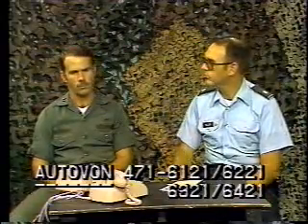Okay. One last question before we leave, and we've just about covered this topic about as well as anybody could cover it. No sense in beating a dead horse. You see a lot of situations in the movies and in the field where a man will put a harness over his shoulders and attach it to the handles of the litter, so that a lot of the weight is on his shoulders. In other words, when he stands up, it's actually a harness type of thing. Is that an approved method? Is it something we commonly do?